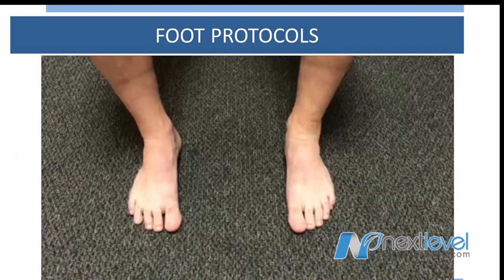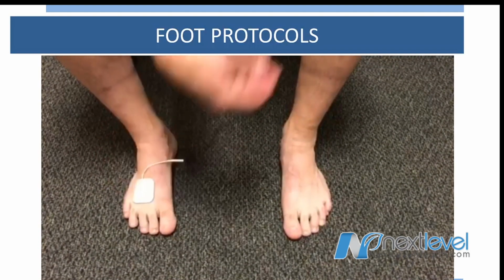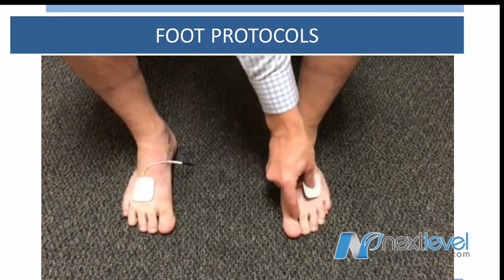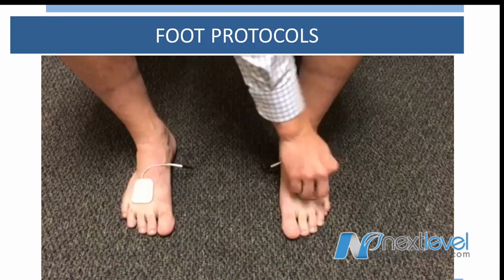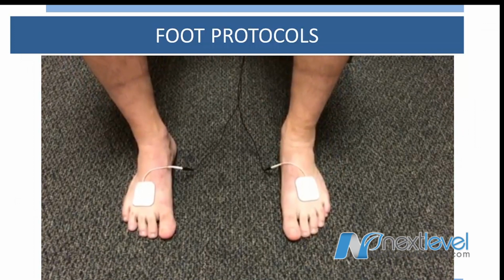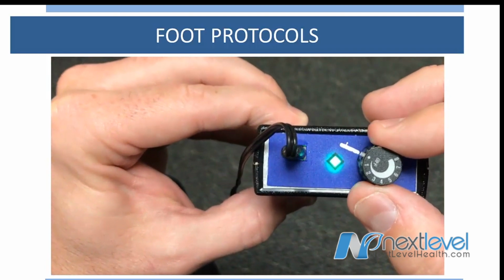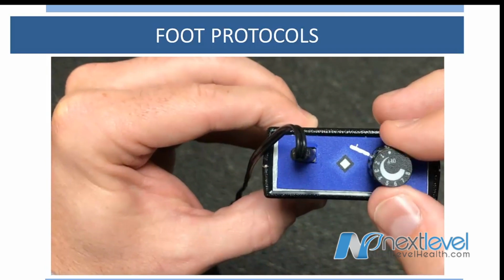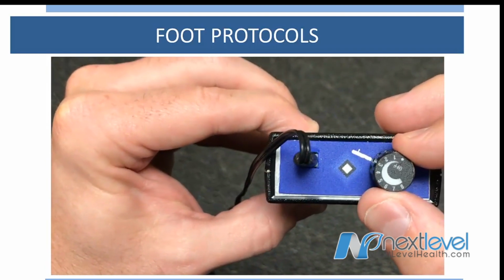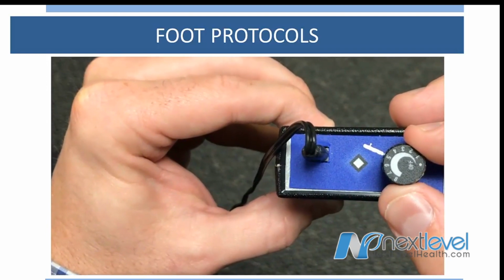If you have a foot problem only or have to work on your feet and your hands, follow the exact same steps for your feet. You will put one of the sticky pads on the top of your left foot, one of the sticky pads on the top of your right foot, then turn the unit up to a 4 to 5. After 15 minutes, turn the unit off, remove the sticky pads, and place them back in the sealed pouch.